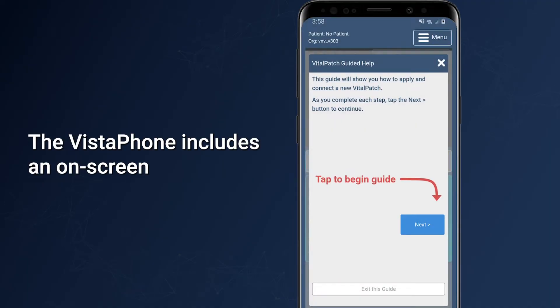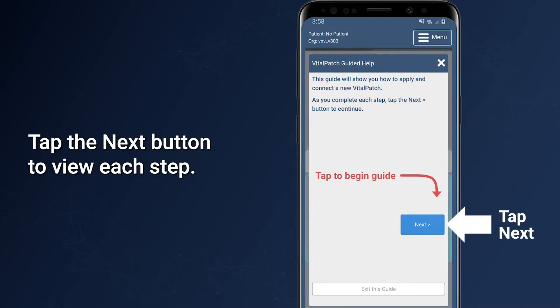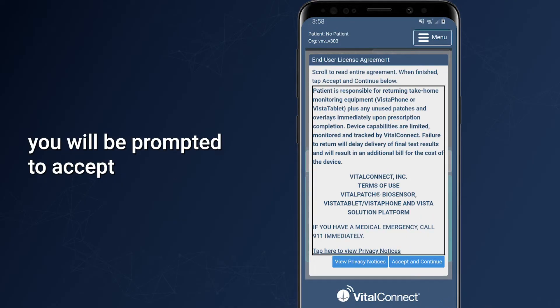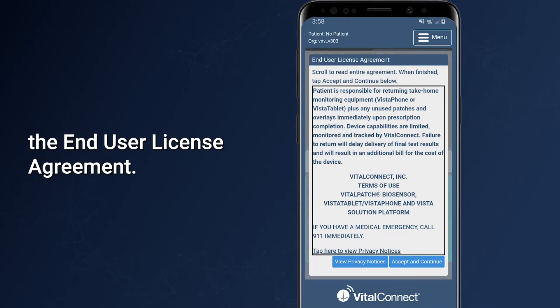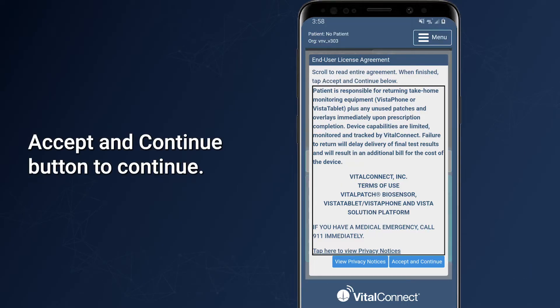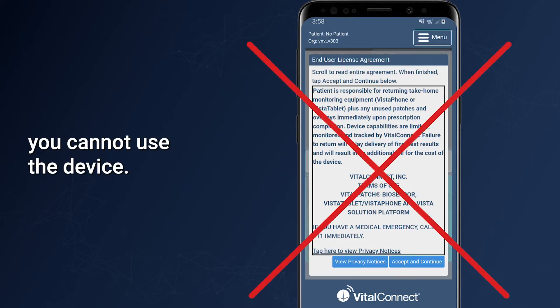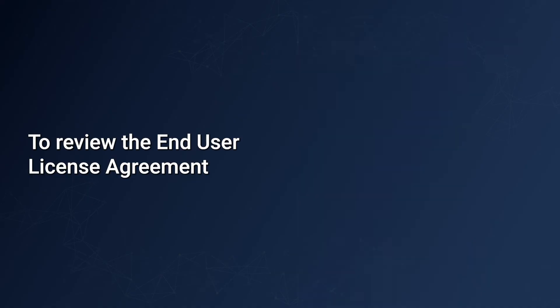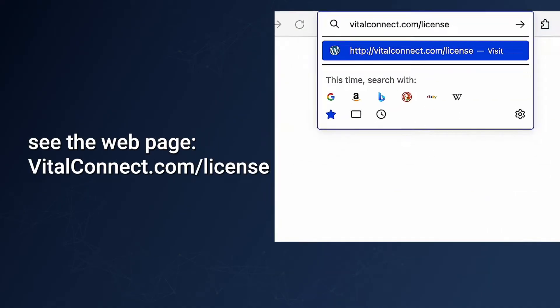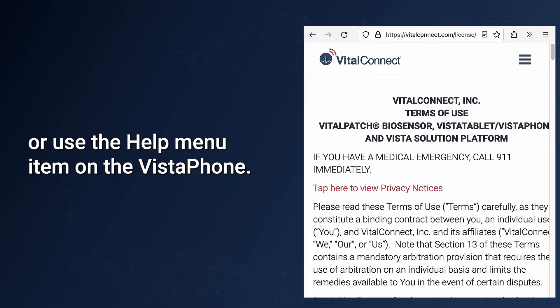The Vistaphone includes an on-screen help system that can guide you through applying the Vital Patch. Tap the Next button to view each step. The first time you tap Next, you will be prompted to accept the end user license agreement. Read the agreement and then tap Accept and Continue to proceed. If you do not accept the agreement, you cannot use the device. To review the end user license agreement and privacy notices in greater detail, see vitalconnect.com/license or use the help menu on the Vistaphone.